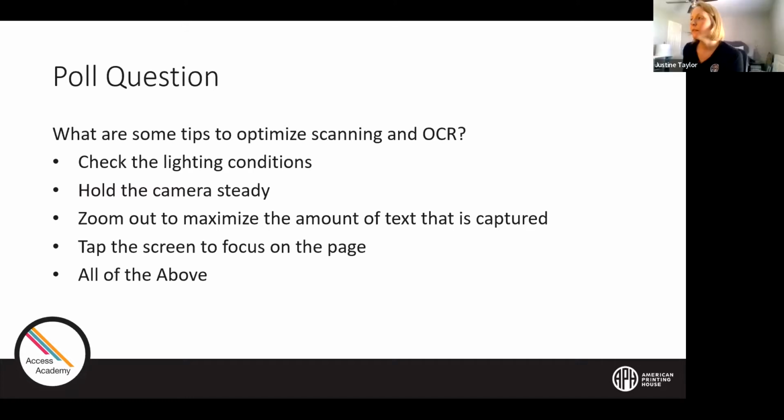Yes. Sure. So the Ruby 10 is a larger screen. The Ruby 10 has the 10-inch screen. The Ruby 10 does not have the rotating barrel camera. So the Juno is a little bit smaller screen, and it has that camera that will do a little bit of distance, close up and self-facing. The Ruby 10 doesn't do self-facing, but the Ruby 10 does have the fold-out arm to do full page, 8.5 by 11. So it gives you the power of the desktop video magnifier with that 10-inch size.